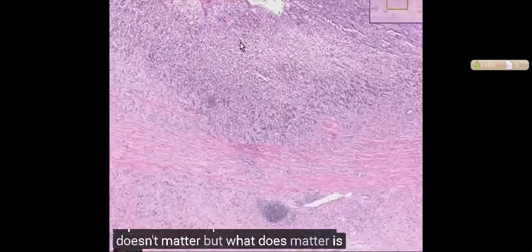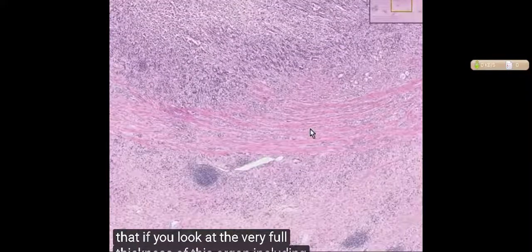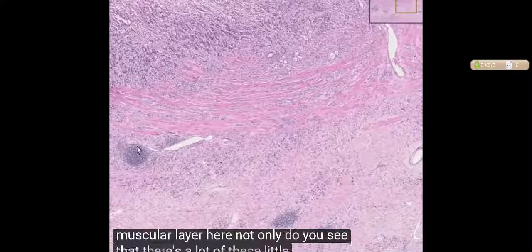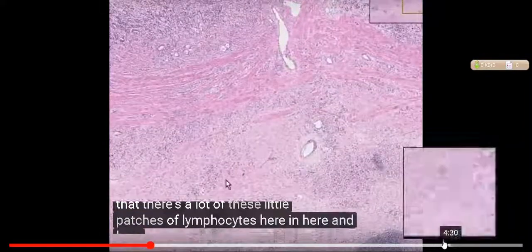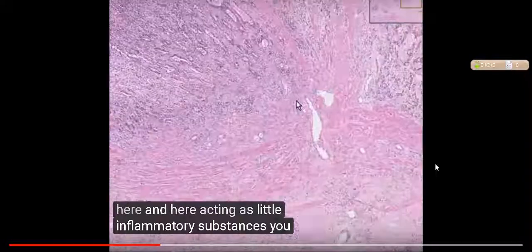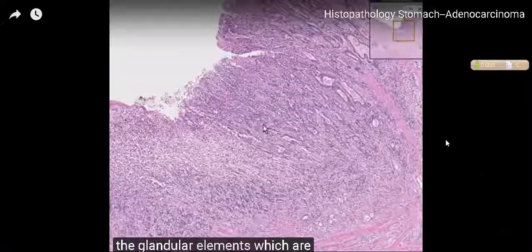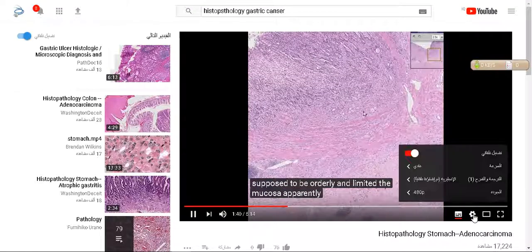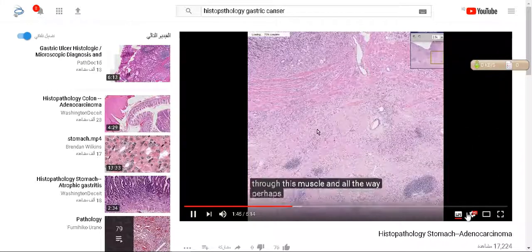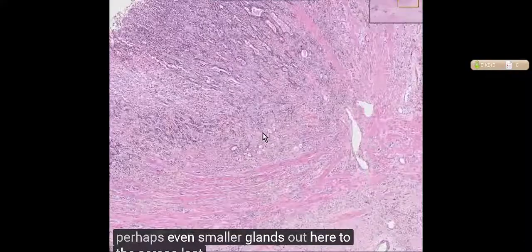But what does matter is that if you look at the very full thickness of this organ, including the muscular layer here, not only do you see that there are a lot of these little patches of lymphocytes here and here and here and here, acting as little inflammatory substances, you could see that the glandular elements, which are supposed to be orderly and limited to the mucosa, apparently have infiltrated through this muscle and all the way, perhaps even smaller glands out here to the serosal aspect.